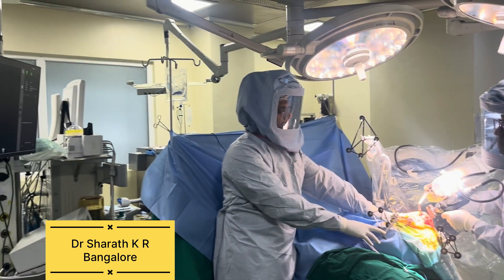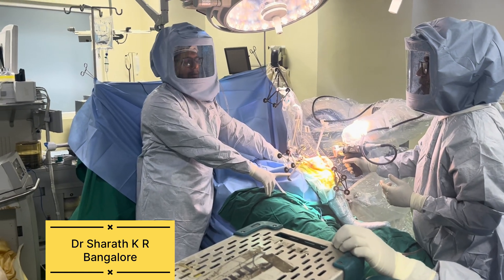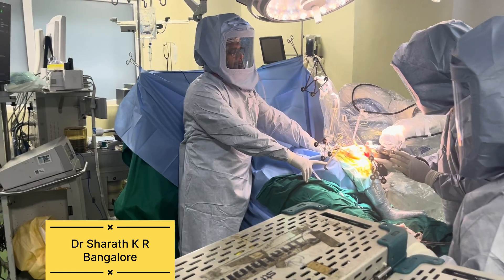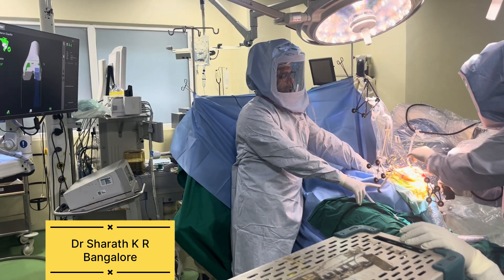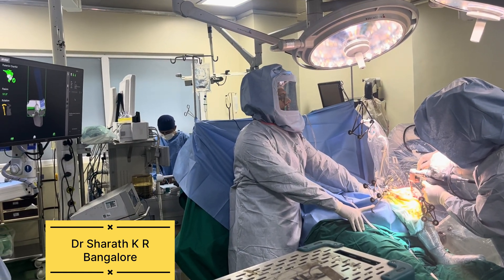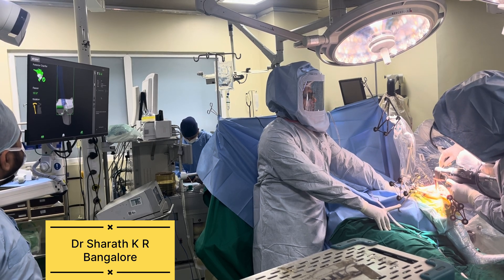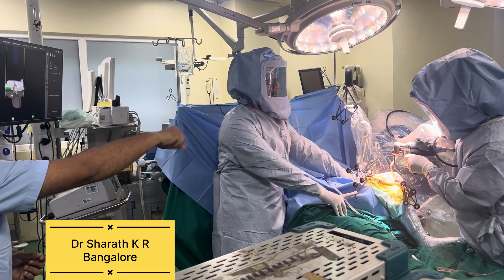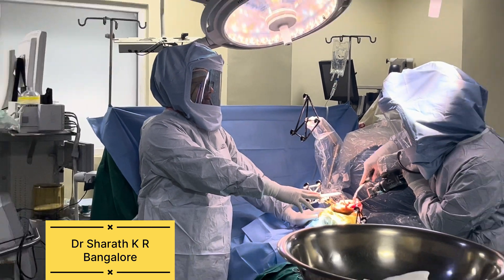Now you can see that we are completing the process of bone resection. After we complete the bone resection, the next step is trial implantation. Depending on the type of knee, if a box resection is required, it will be done with our instruments. In trial implantation, we check how much gap is there after placing the implants, how much the knee is bending, how much it is extending, and what is the balance of the ligaments. This objective confirmation of balancing and alignment is directly available to the surgeon during surgery — this is the advantage of robotic knee replacement.